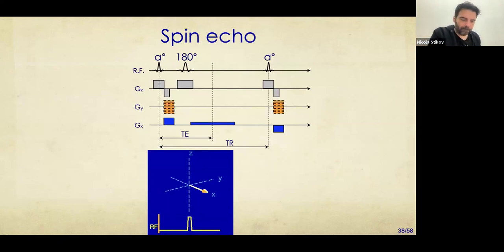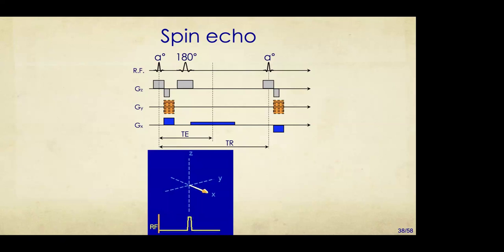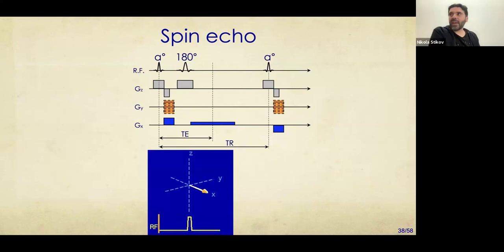Srijani, there's a question? Yeah, I wanted to clarify if this is like a compensating mechanism. So it is, absolutely. Basically, what's happening is the B0 field, the main magnetic field, is never perfectly uniform. And even if it was, there's different kinds of spins in the body. So maybe the hydrogen atoms are perfectly tuned to the resonant frequency, but there's other isochromats, other components that will precess at slightly different frequencies. So to be able to compensate for this, take a look at this video.